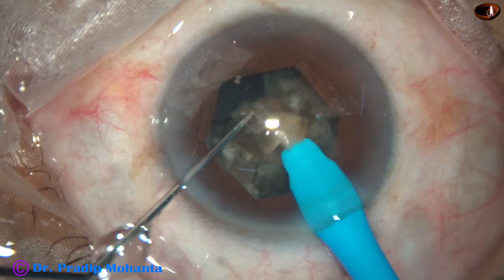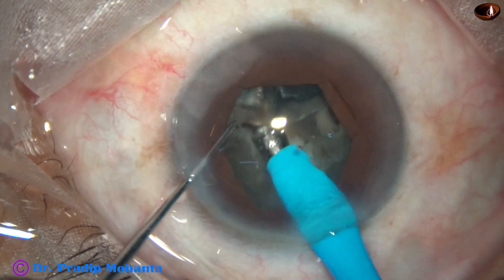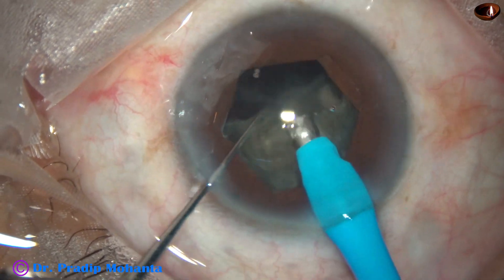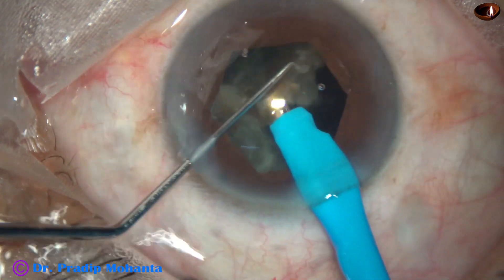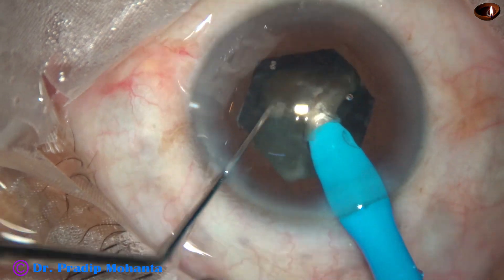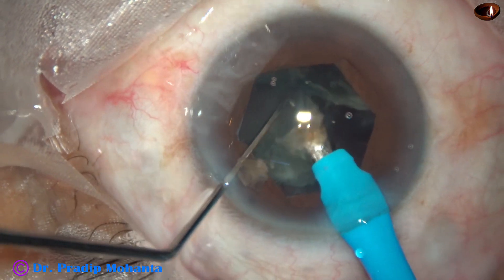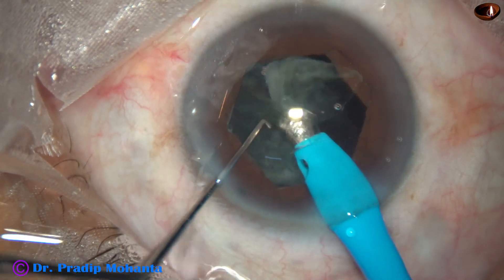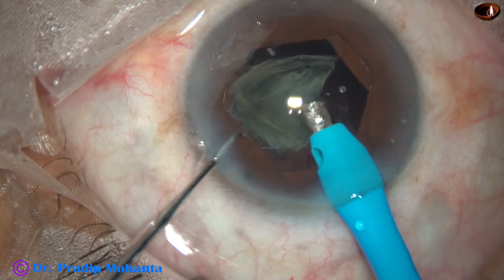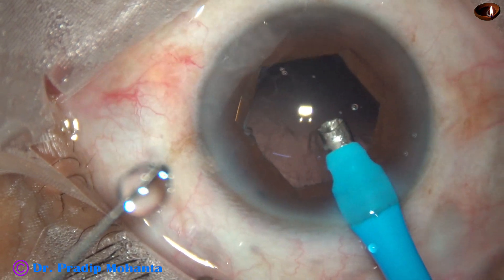Each fragment is tilted. The machine being used is Alcon Infiniti Pharos, and this is longitudinal ultrasound — there is no torsional component. In such hard cataracts, sculpting is tough, but with this technique we can manage the nucleus easily. From the very beginning, the ultrasonic energy is 85% in continuous mode, flow rate is 45 ml per minute, and vacuum is 450 mmHg. At this time the parameters have been reduced when the last bit of epinucleus is being managed — vacuum around 300 and flow rate 30.